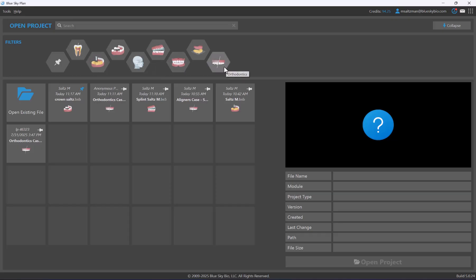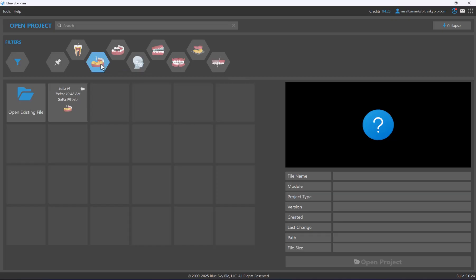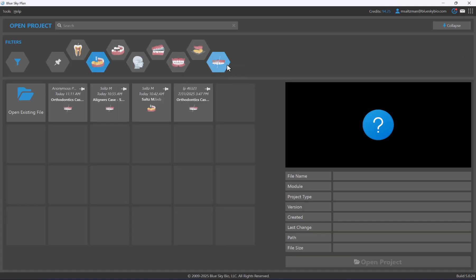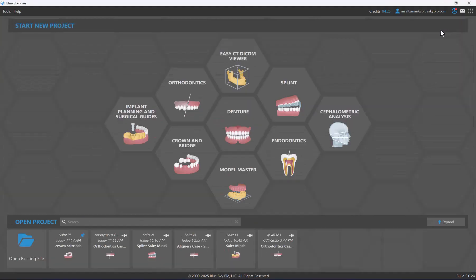We've also introduced filters based on treatment type. If you'd like to see only your aligner cases, click the filter for orthodontics and you'll see only those cases. For implant cases, use the surgical guide filter. To clear the filter, click once again on the relevant hexagon or click the filter option. You can also select both orthodontics and surgical guide to see those combined cases.